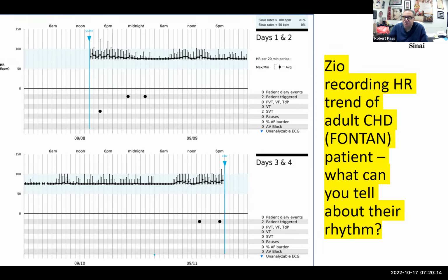We had a very interesting example of this just a couple of months ago. One of my patients had an epicardial pacemaker defibrillator, which had been in place essentially since he was 3 years old up until his mid-20s. Finally, one of his external patches broke, and so we upgraded him to a transvenous standard dual chamber pacemaker defibrillator.